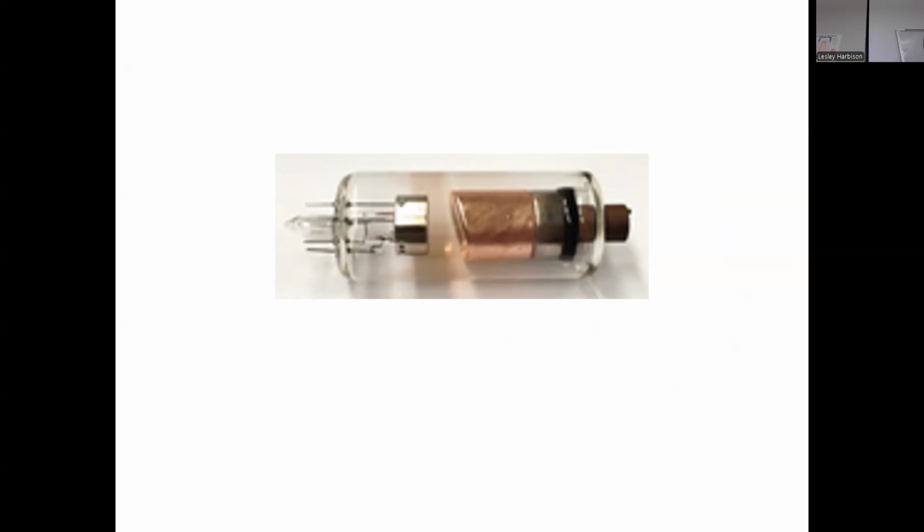It probably depends, but you can see the copper. It looks copper, and you can't really see it because it's embedded in it. But where the copper is slanted inside the glass, that's where the tungsten target is going to be. And the metal part across from the copper, that's the focusing cup. You just can't see the concavity, and you can't see the filament because we're just looking at it from the side. But if you did a cross section of it, you would see those parts.